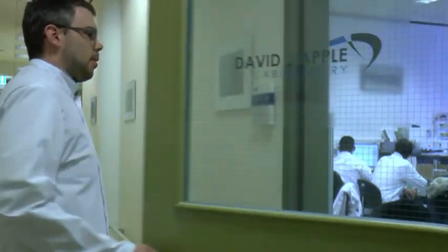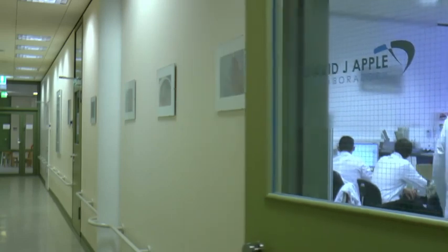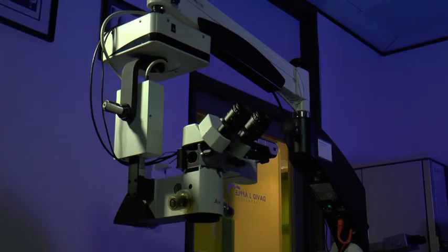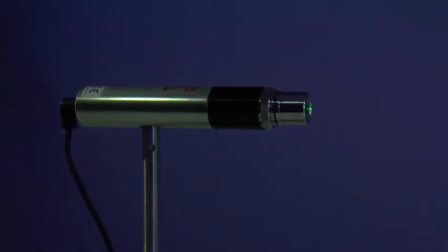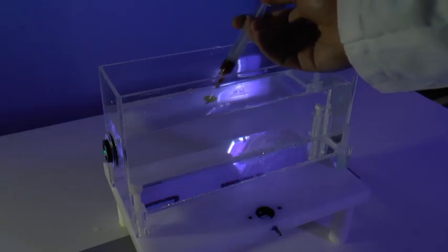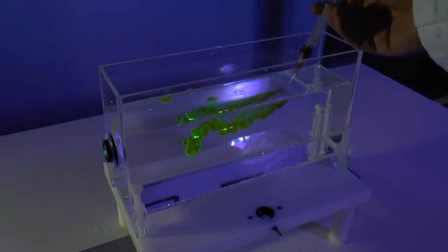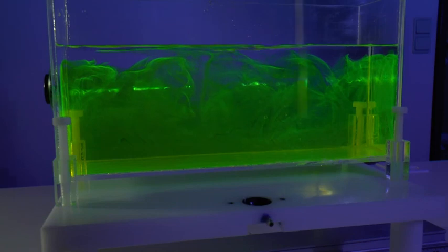How can we visualize the optical pathways of all these lenses? For the experimental setup for the study, we used a green laser source, as you can see here, and we stained a water bath with fluorescein in order to visualize the optical pathway through the lenses with this green laser.